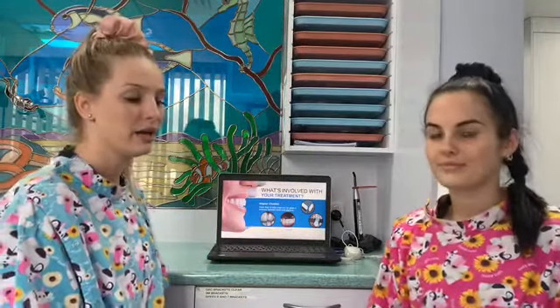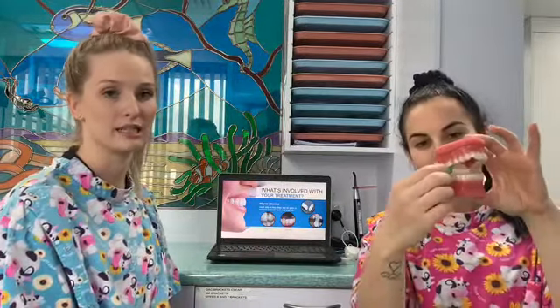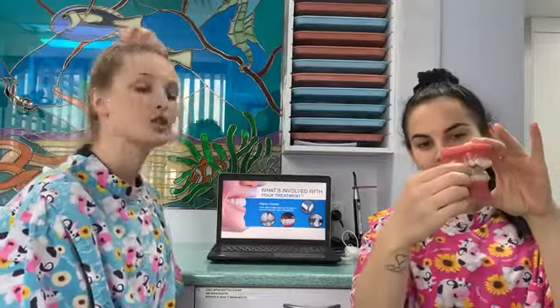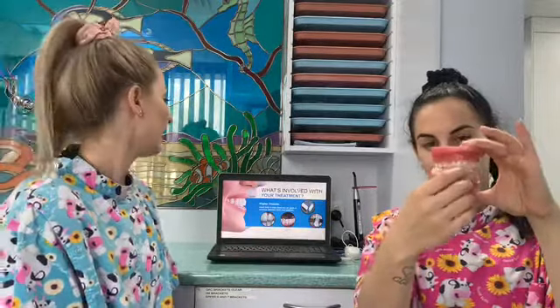So aligner chewies are a really important part of your treatment. They're a little soft rubbery cushion and we use these just to bite down on every surface to make sure that our aligners are seated correctly. We want to make sure that we're using our chewies for 5 minutes throughout the day to ensure that our aligners are seated. We want to make sure that we don't have any windows between the teeth and the aligners.